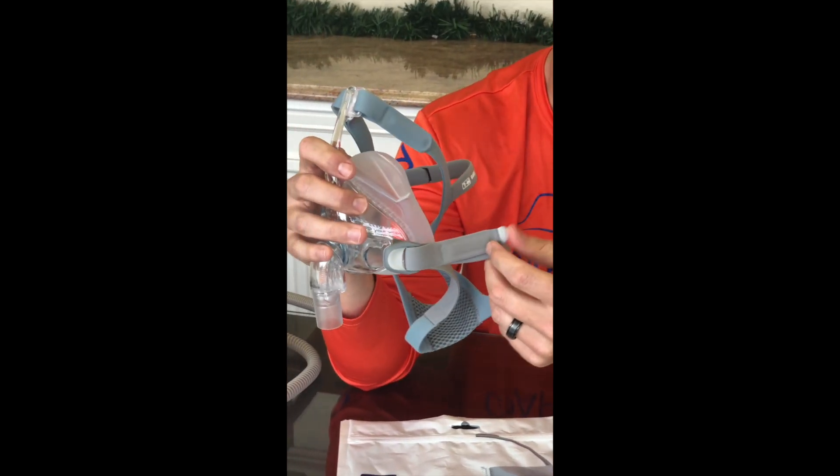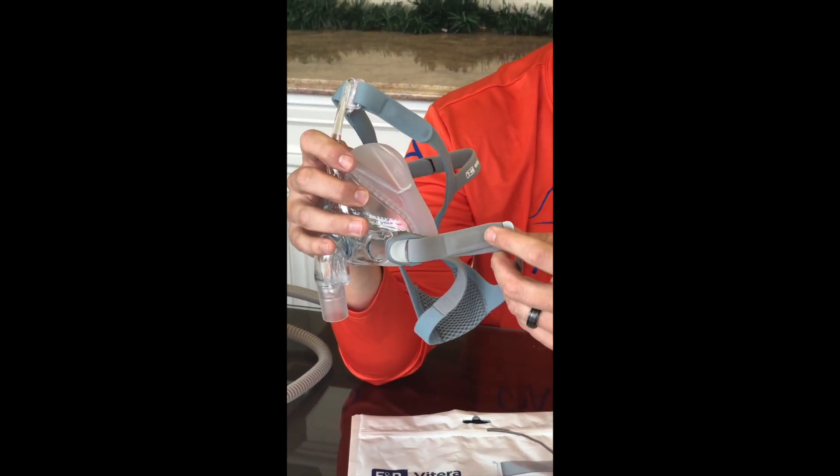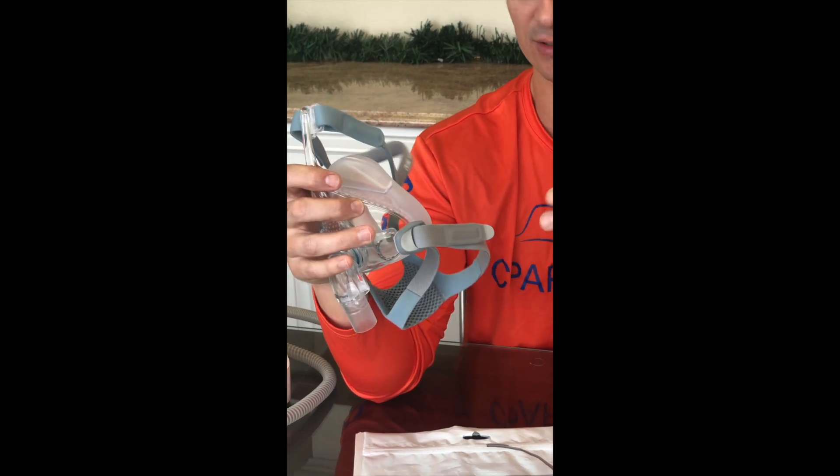You'll also notice there are little tabs now on the headgear velcro strap as well. When you're not looking at a mirror, you can feel back there to find it for a quick adjustment.